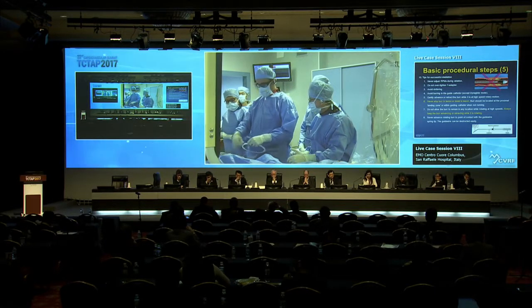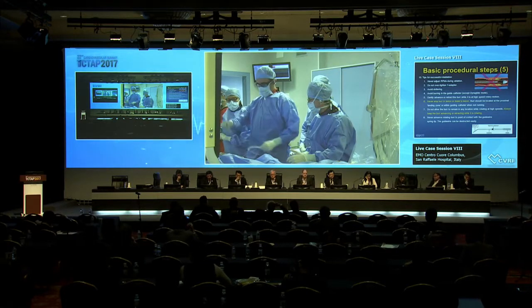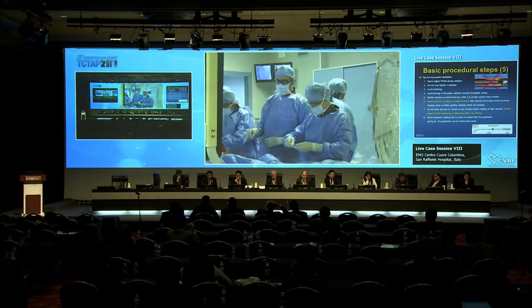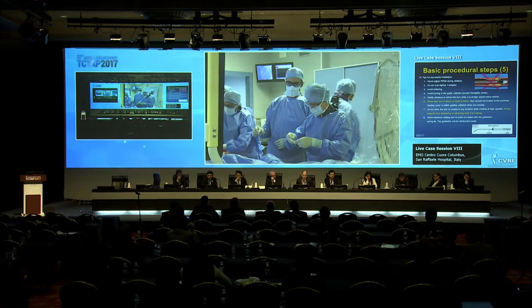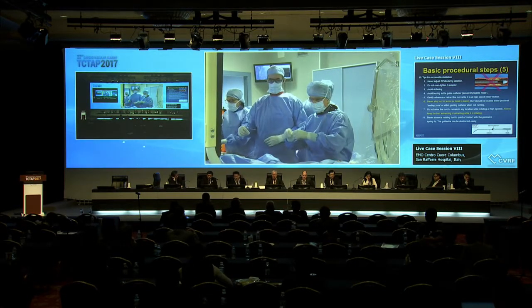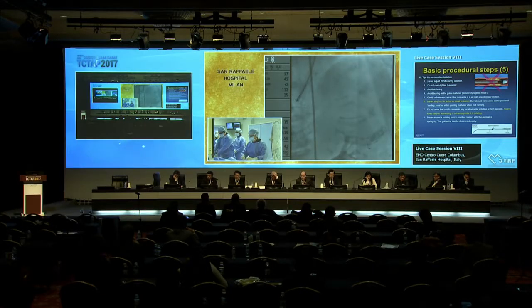Any comments? Would you have done the same or would you have done differently, Yves? For me, exactly the same. So you plan to put a 2.5 stent distally and a 3.0 long stent proximally. That's your plan? Yeah. Because as we see, the vessel now is big, even after the distal diagonal. Goes down, and then maybe we go back to Lati, to Azim. You have the wire.